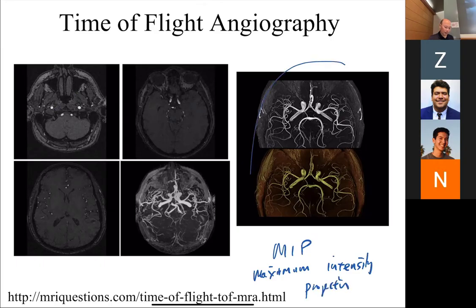And so you get these beautiful images of the vasculature. So you get some sort of 2D projection. Yeah, it's a maximum, but it's not a projection like in CT where we take the integral. You just take the maximum along any ray vector. It's just a way of visualization that's used quite a lot in medical imaging.